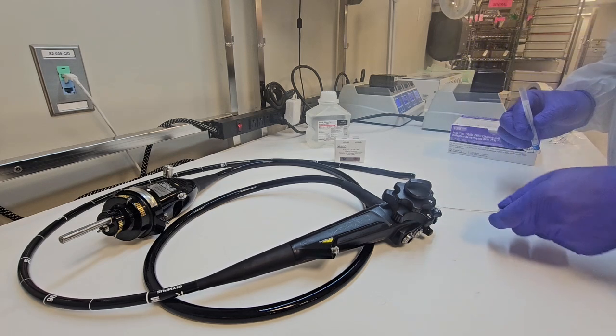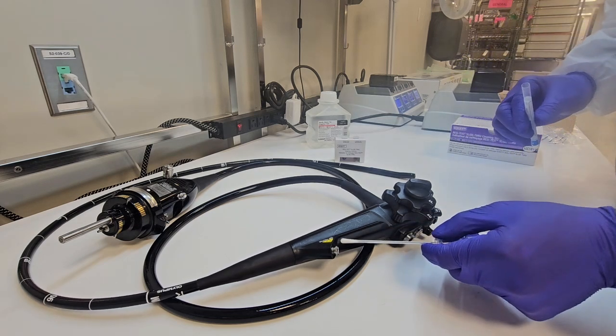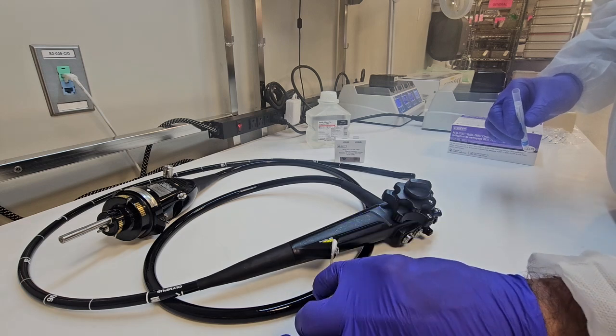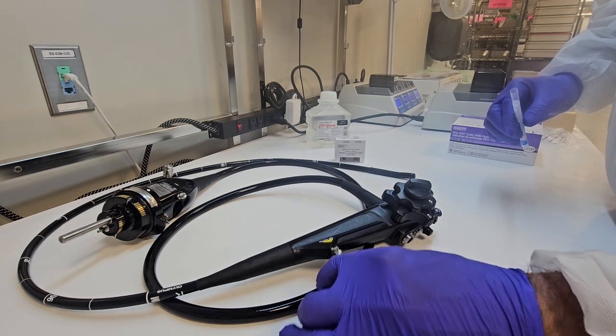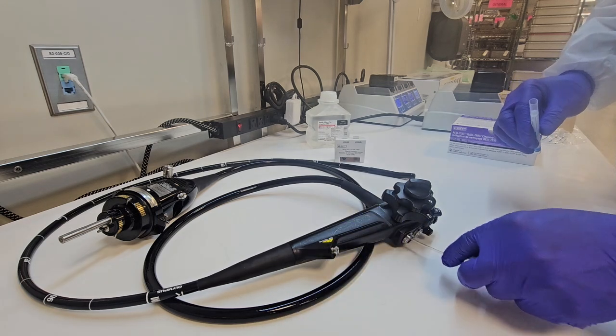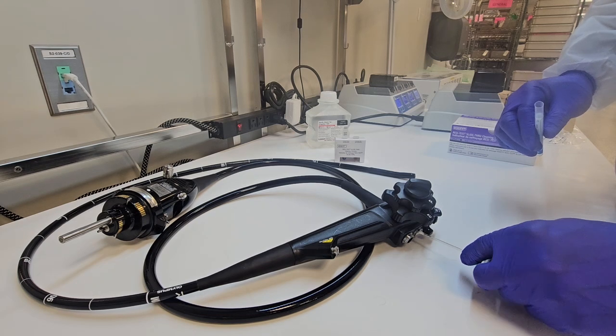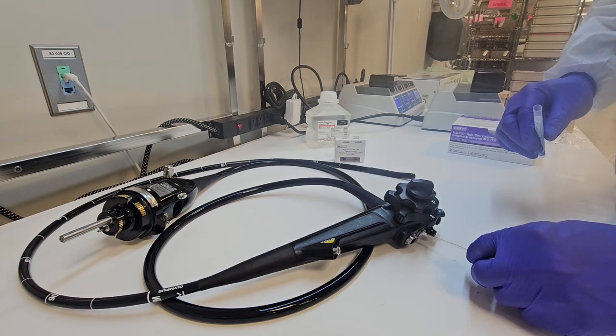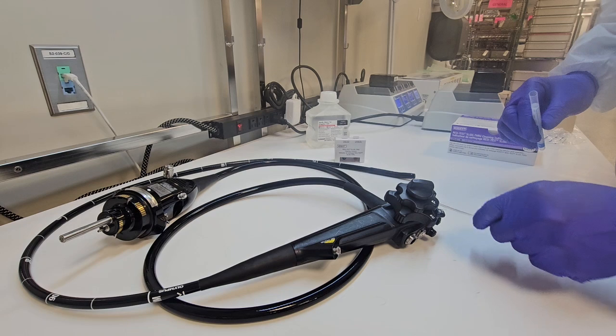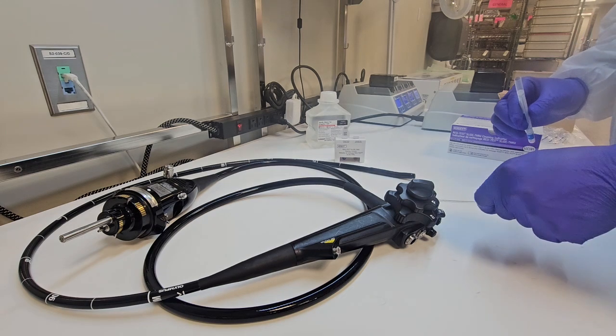And I'm going to swab in areas that I feel are the most challenging, which is around the control body and those knobs. As stated, we use non-linting wipes, towels and/or sponges. So do we truly get in between those knobs really good? And if we're using a brush to brush those areas, are the bristles long enough to get in between those knobs?